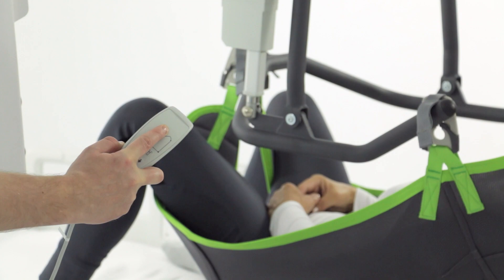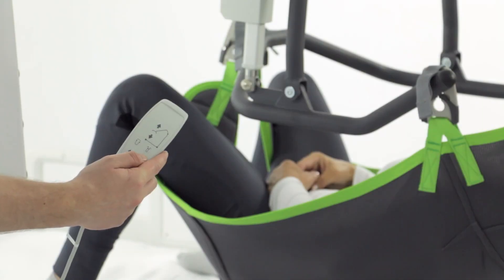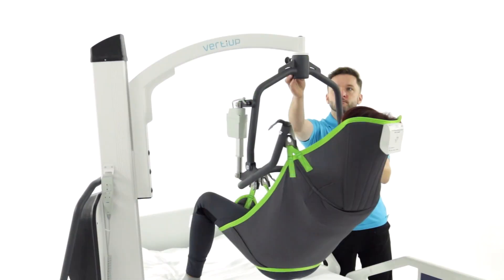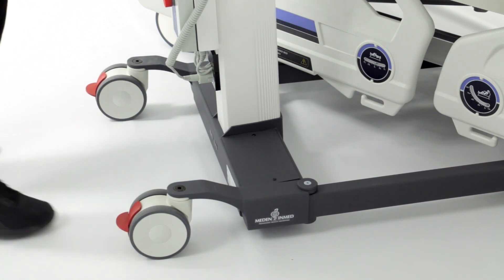Keeps the patient at the same distance from the column during lifting and lowering, invaluable in smaller spaces. Designed with attention to detail, with components from renowned companies like Tenta and Linac.